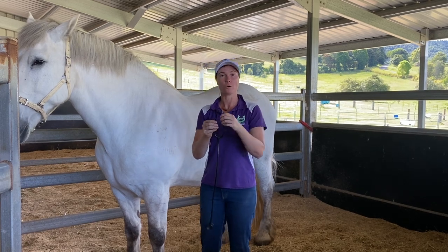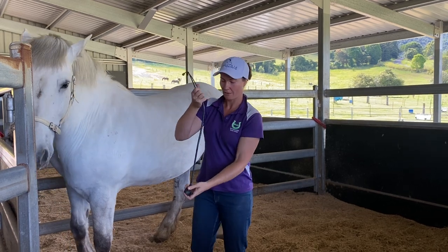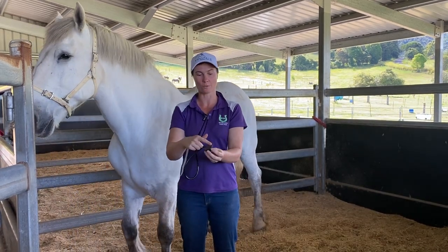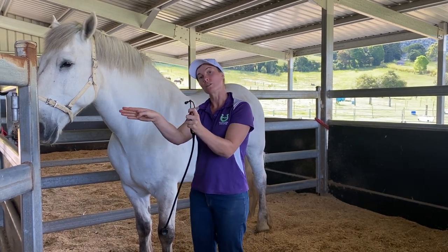Your stethoscope has your earpieces and of course your piece at the end to listen for your horse. Please note, the large part of your stethoscope goes on to what you want to listen to and your earpieces need to point outwards.